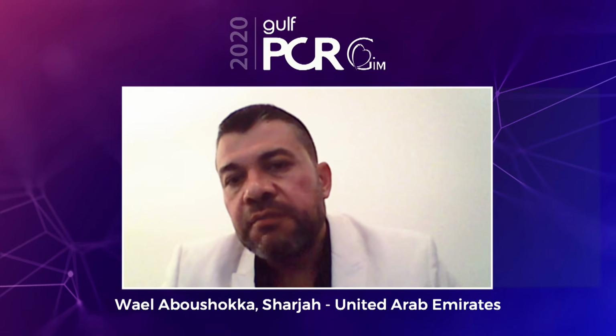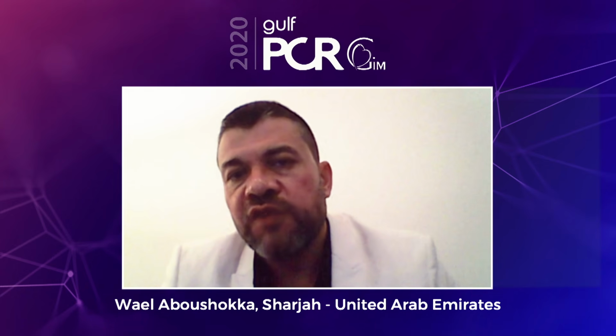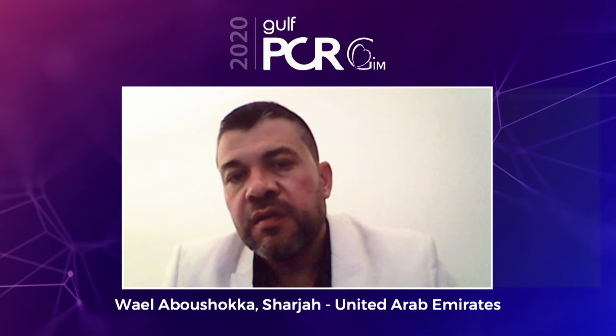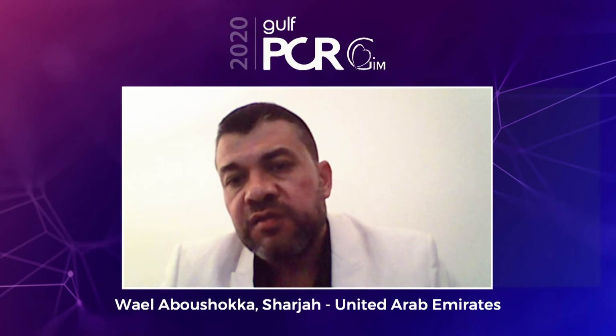In big diameters, 4 to 4.5. It works up to 4.5 actually, but to go 4 to 4.5, you need to increase the speed to 120,000 RPM. And if you have deeper calcium, by intravascular imaging, you can identify it by IVUS, but it's better by OCT to identify the deeper calcium.